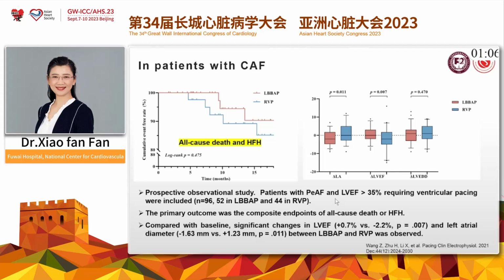However, when we focus on the echo parameters, we found LBBAP could significantly reduce the left atrial diameters.